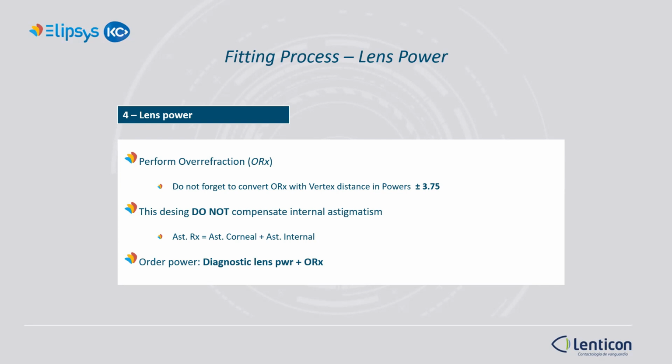Remember that this design does not compensate for internal astigmatism. If this astigmatism appears, we must consider other designs, such as ICD flex fit.